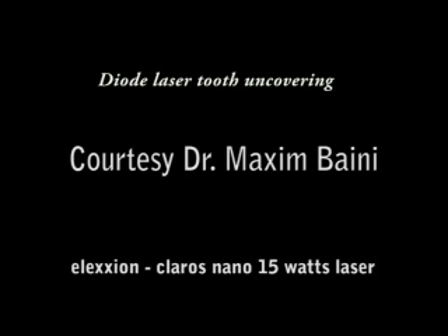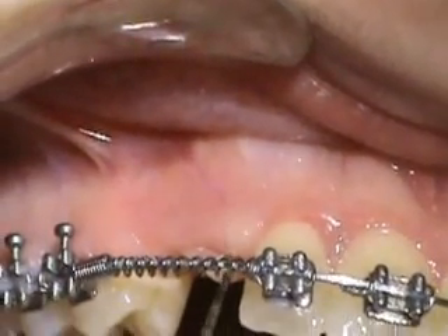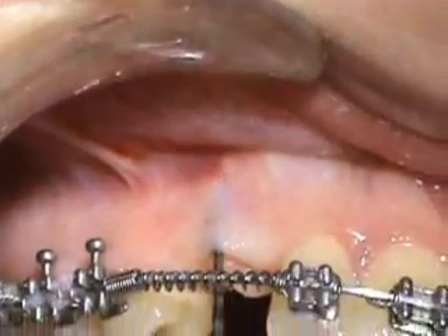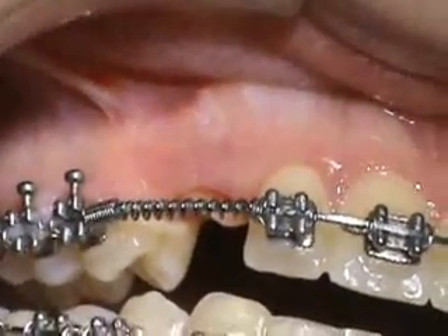Hello, hi. I am Dr. Maxim Baini, a periodontist from Lebanon. I will show you in this video how to make an uncovering for the tooth using diode lasers. First, with a periodontal probe I will mark the point or the level to which I have to make the cut.